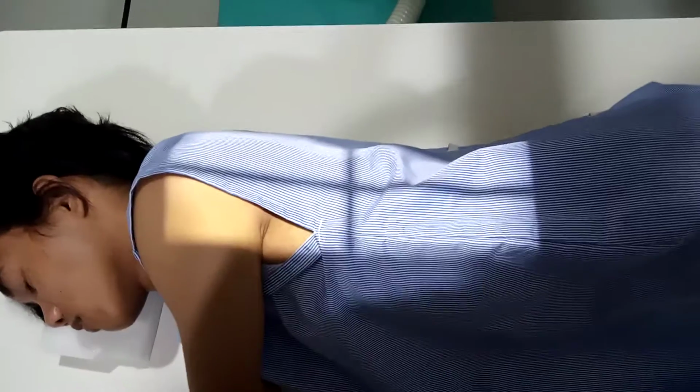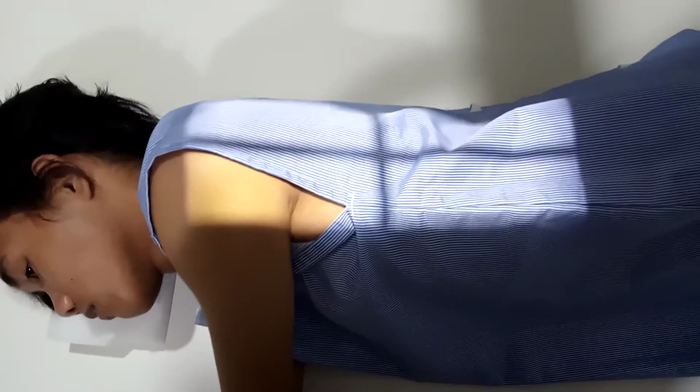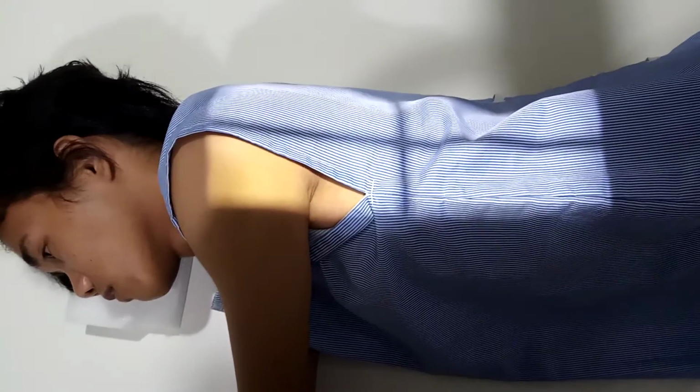So in anatomy demonstration, evaluation criteria, the thoracic vertebral bodies, intervertebral joint spaces, and intervertebral foramina of thoracic 1 to thoracic 3 will be clearly visualized.